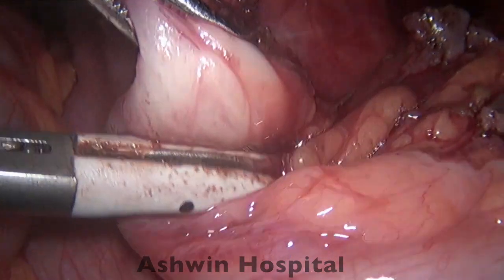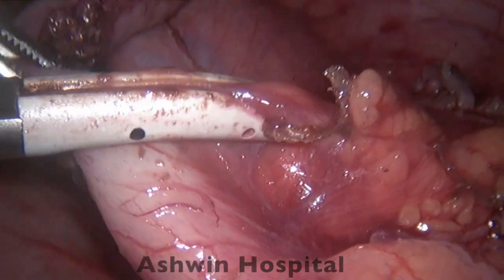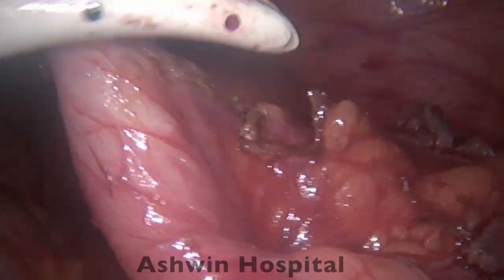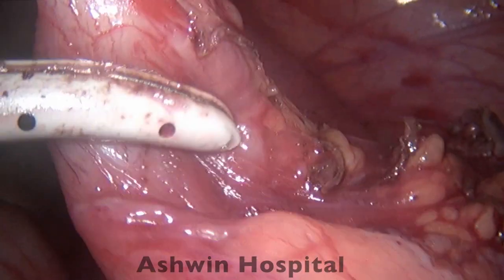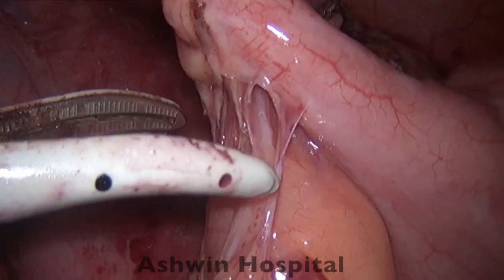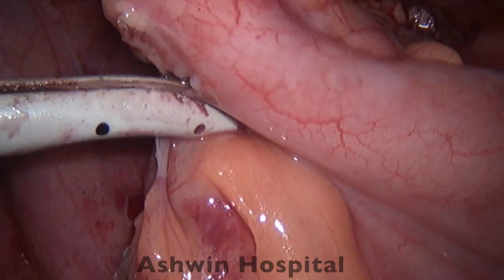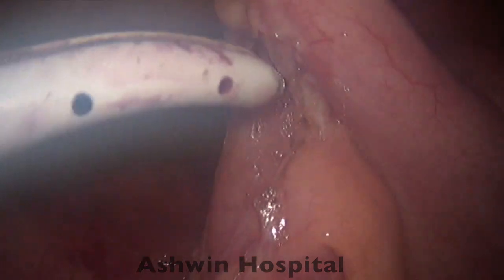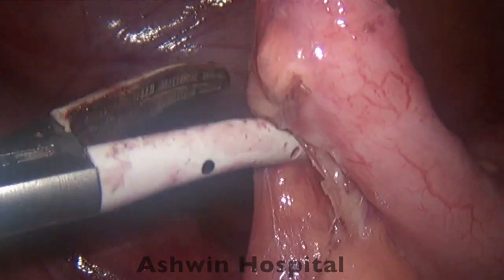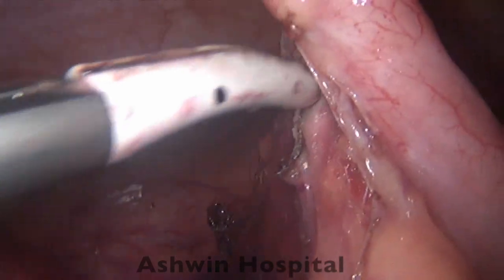Once we flip the appendix, additional adhesions are present and easily taken down with the energy source — not many major vessels, they are flimsy. A vessel branching from the appendicular branch of the ileocolic artery is identified; small branches are easily cauterized using energy sources or bipolar. We refrain from using monopolar too much at the level of the base. Coming very close to the base, the anterior and posterior leaves of the peritoneum are dissected separately for better control over the tissues being coagulated.